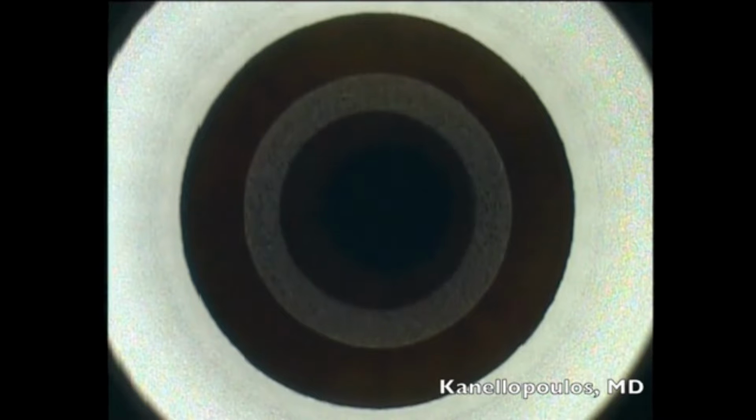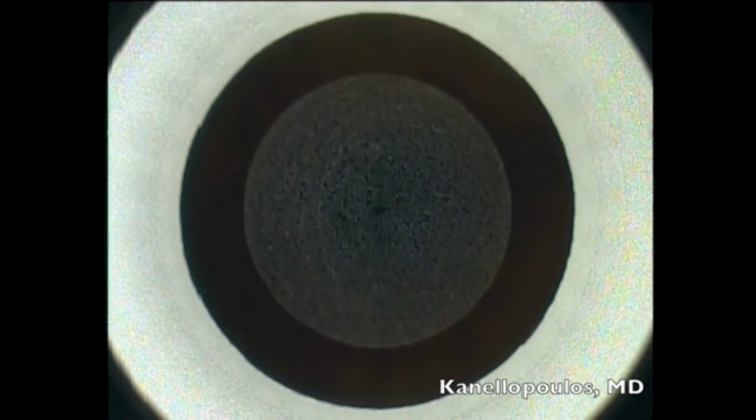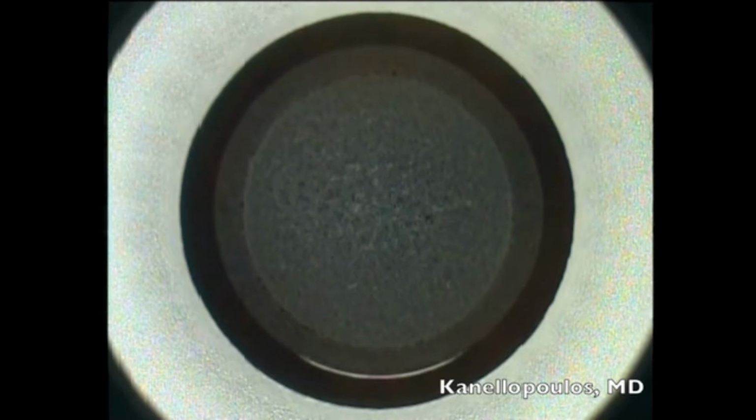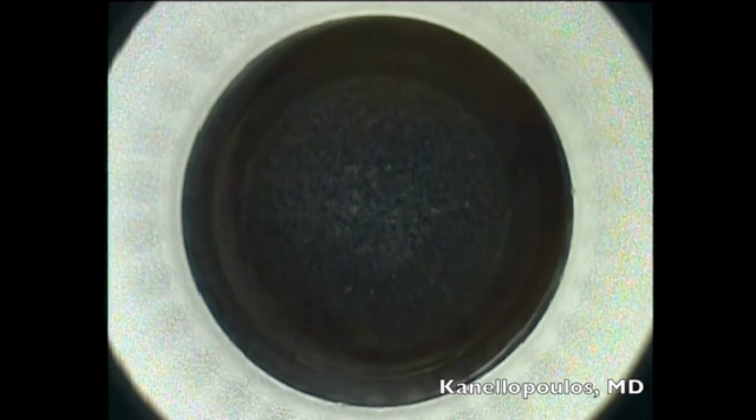The device is capturing the cornea, stepping on the pedal, creating first the inferior refractive incision, and then following that, starting reversely from center to periphery, the superior incision, anterior if you may, which as you see is wider, and then the SMILE vertical incision at the 12 o'clock position, 50 degrees in angle, from which we'll enter to remove the lenticule.